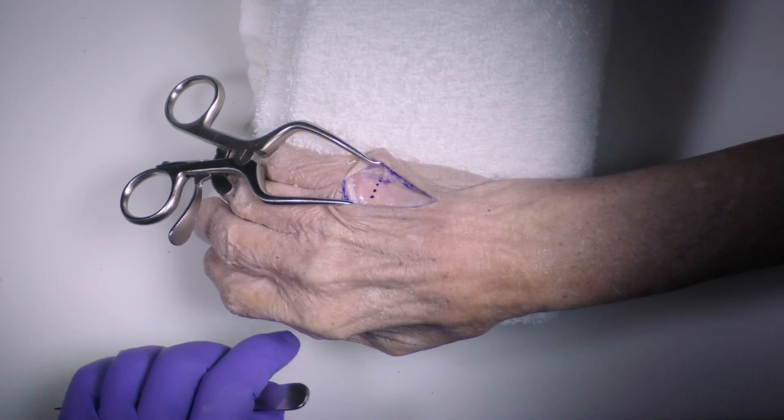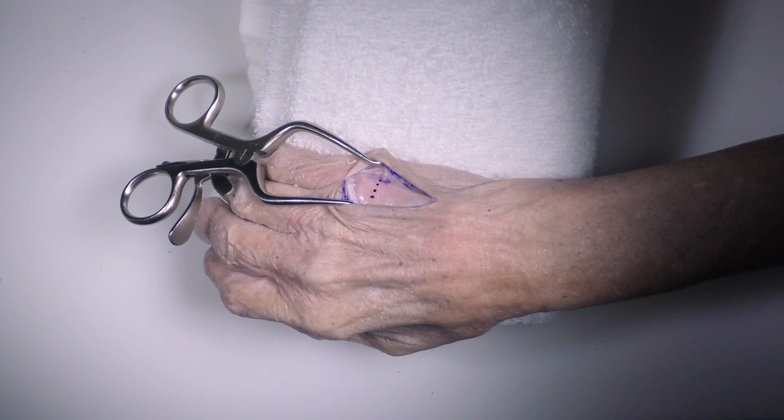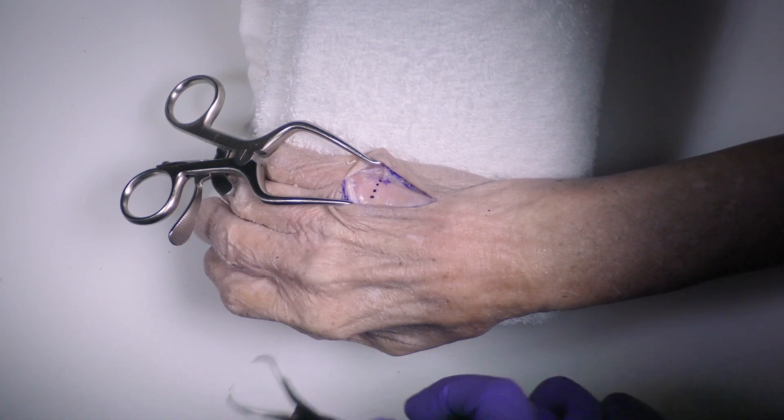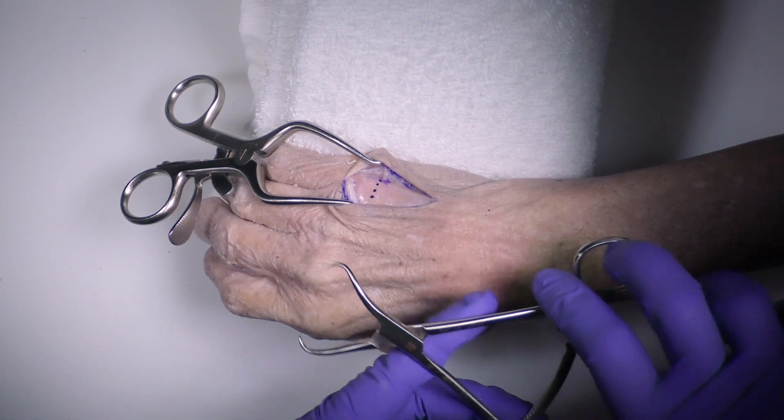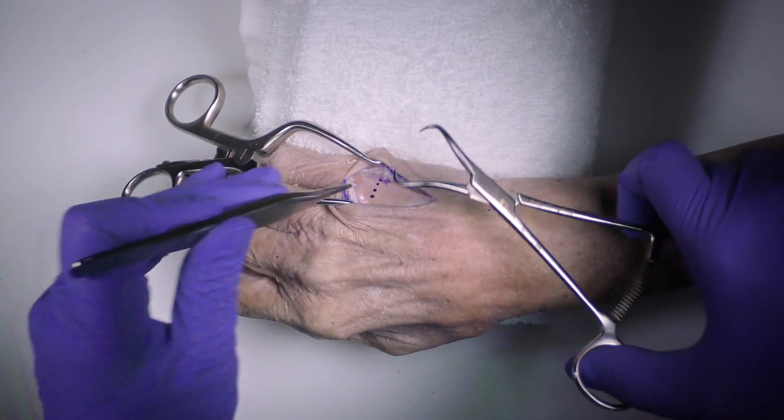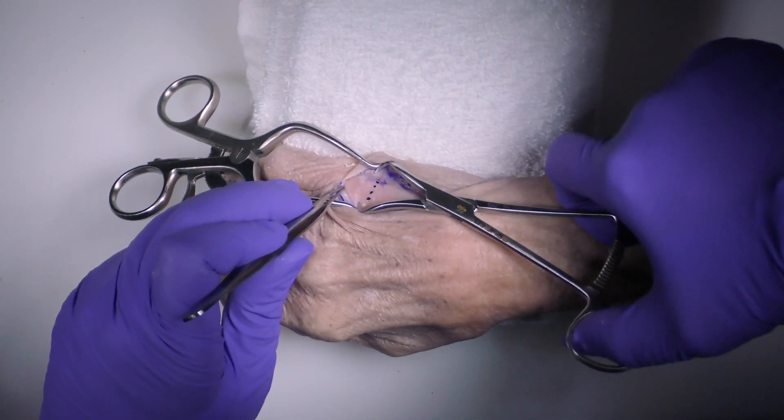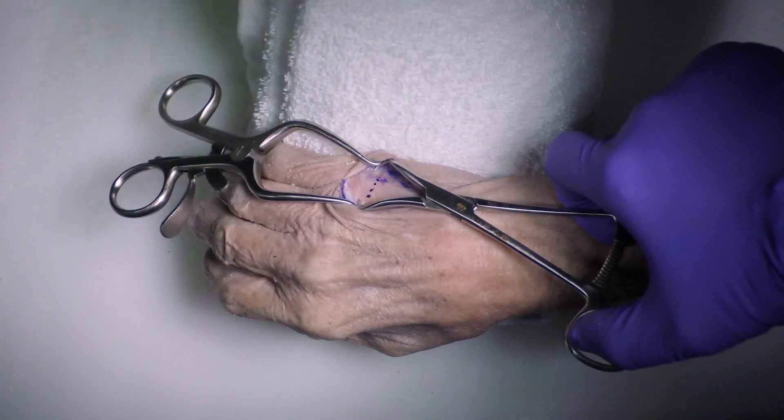And you'll reduce that in a few ways. What I find to be a very easy way to reduce this is, I have a fractured tenaculum please, is once I have it exposed, I'll take a fractured tenaculum, and I will grab this head distally, pull it back, and it's usually flexed.